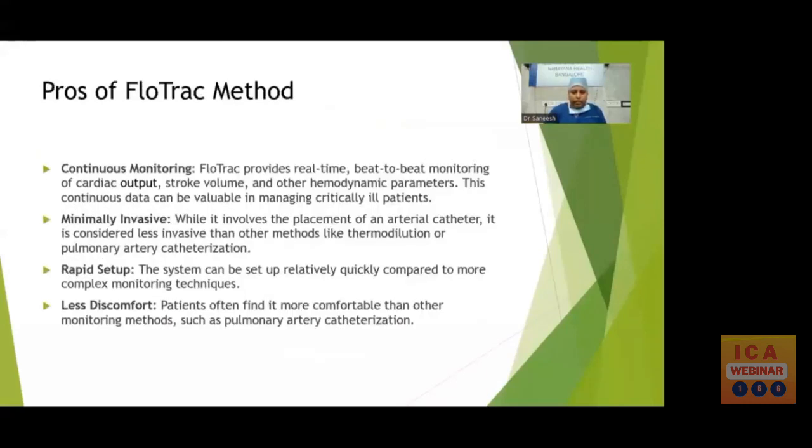Pros of FloTrac: it can be used for continuous monitoring. It provides real-time beat-to-beat monitoring of cardiac output, stroke volume, and other hemodynamic parameters. This continuous data can be valuable in managing critically ill patients. It is minimally invasive. It involves the placement of an arterial catheter. It is less invasive compared to other methods like thermodilution or pulmonary artery catheterization. It is rapid to set up compared to other techniques, and it causes less patient discomfort compared to other methods.